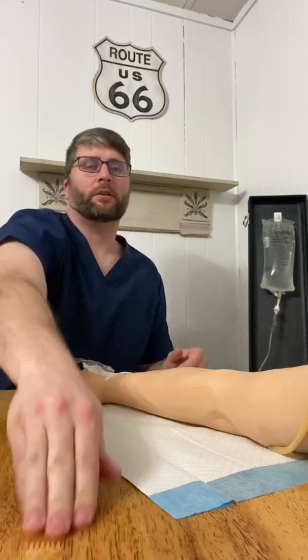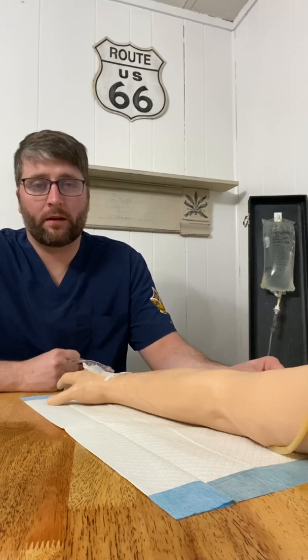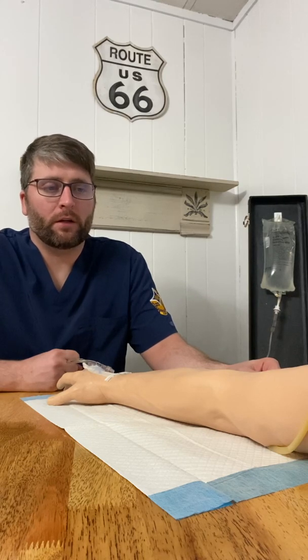All right, welcome back. We are doing IV piggyback and secondary medication administration. We are going to check the MAR to make sure that we have the order to do so, and make sure that we have our right medication and right fluid and everything that is correct.